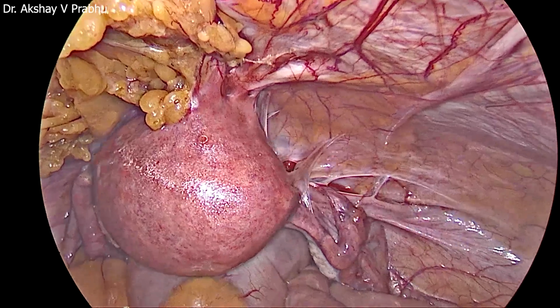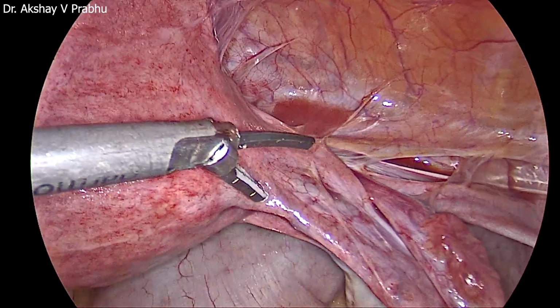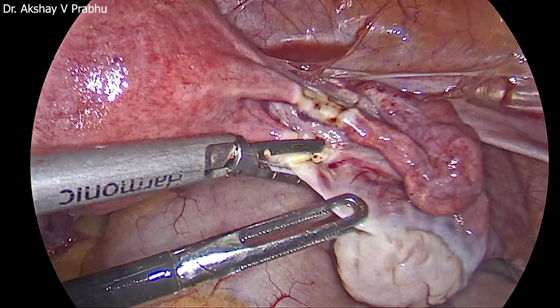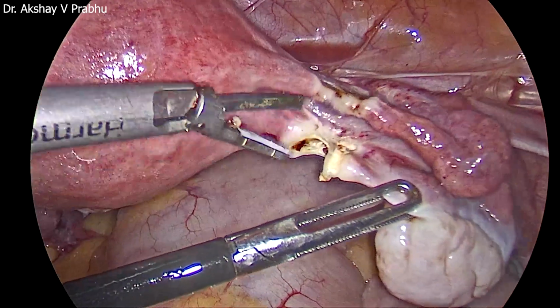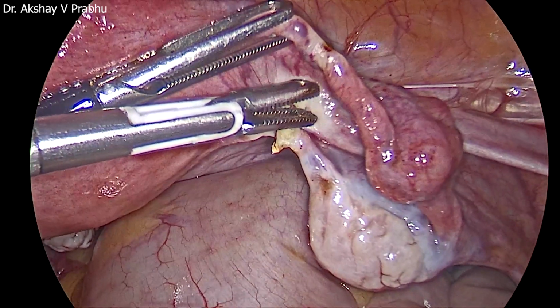On the left side, I have taken the ovarian ligament and the fallopian tube and kept it till the round ligament. I have not taken the round ligament. Right side, I am doing the same thing. You can see the ovarian ligament is on stretch now, and just adjacent to the ovarian ligament are the cornual vessels. So once I take this entire bunch from this side, the vascularity from that side will be compromised. So the uterus will be devascularized a bit.